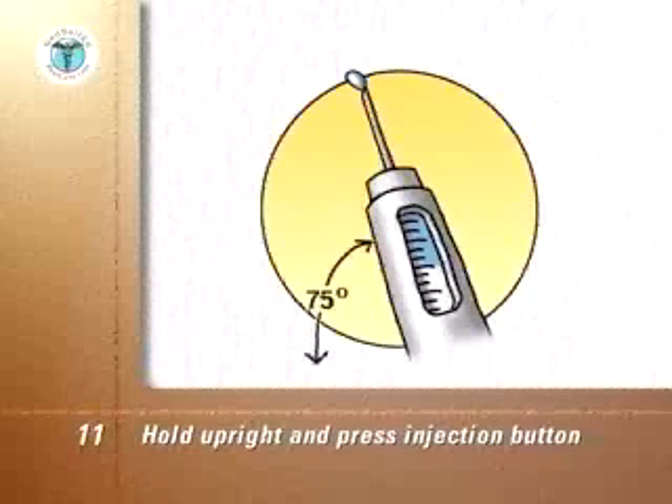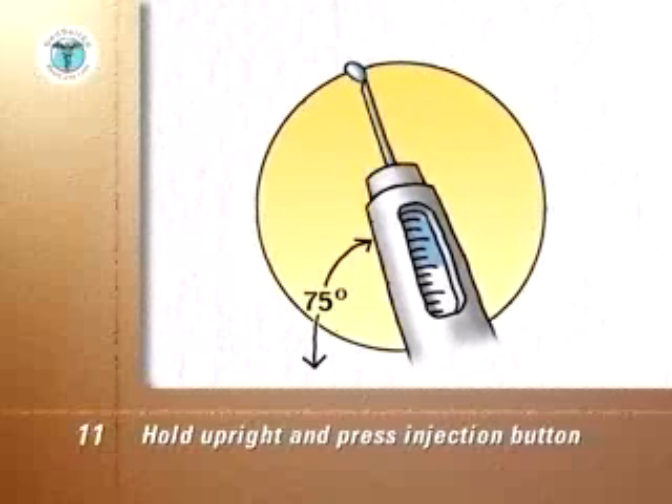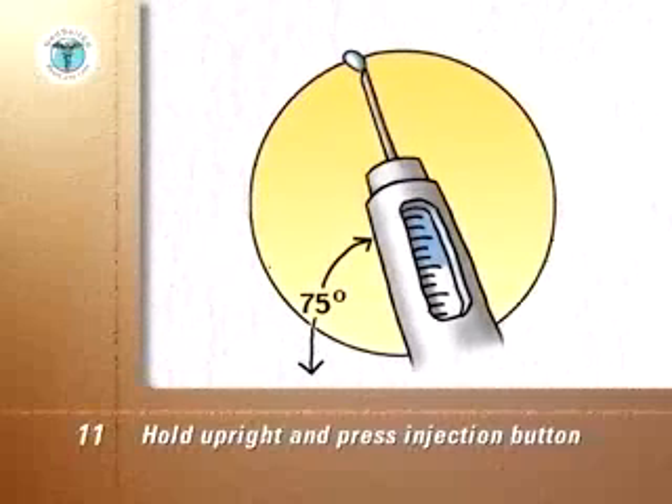If no insulin is seen, continue to dial up one unit at a time and press the injection button until insulin is seen. A new cartridge may take four to six units before insulin flows.